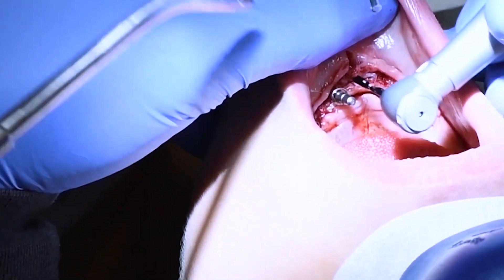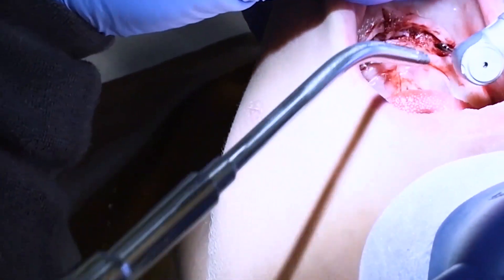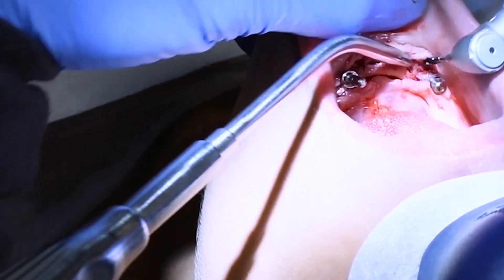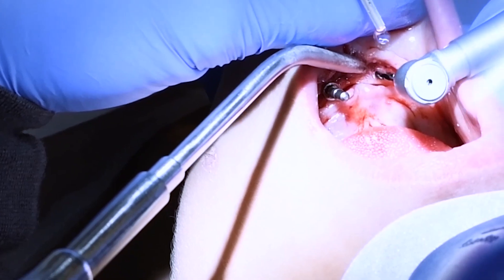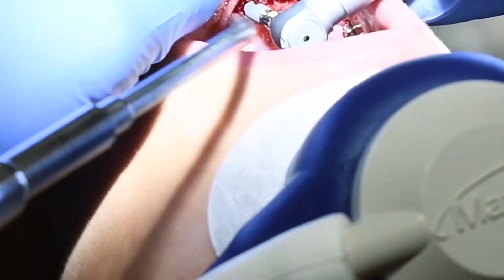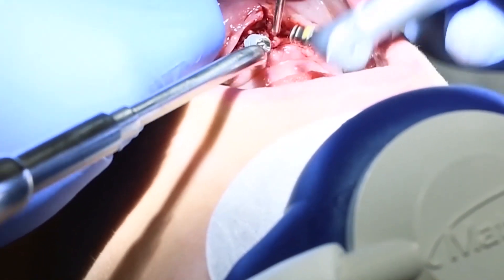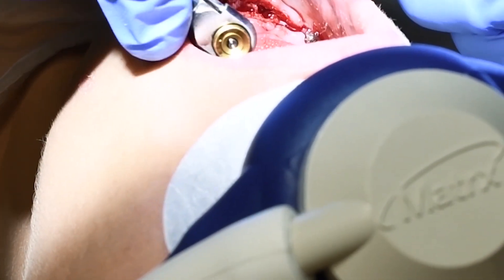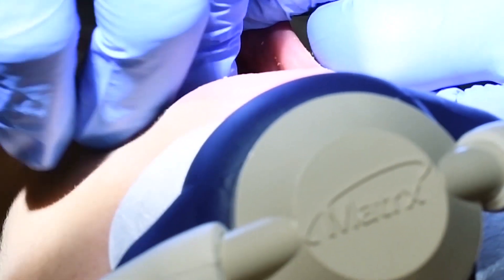I'm preparing the osteotomy — that's a fancy term for just drilling into the bone. There's a little guide pin that will help me stay parallel in all three dimensions for the fourth and final implant. I started in one spot but decided I'd rather be a little more anterior, so I created the osteotomy site there. I'm checking my angles now that both sites are drilled and the holes are prepared in the bone.